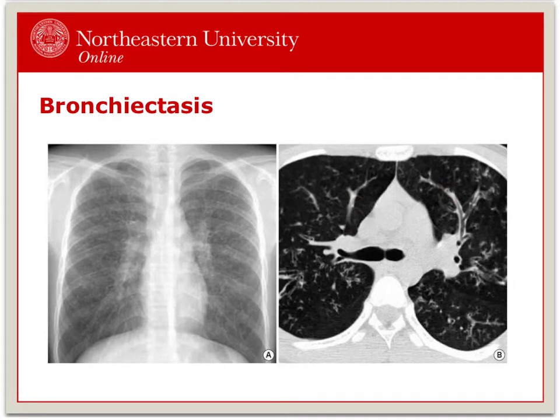PT implications: visualizing these images helps to determine the extensiveness of the mucus plugging, guiding the prescription for frequency of airway clearance.